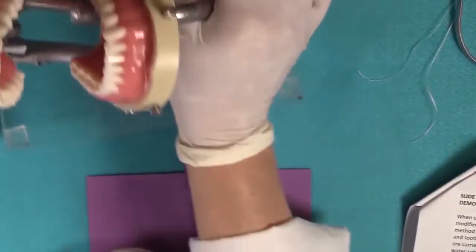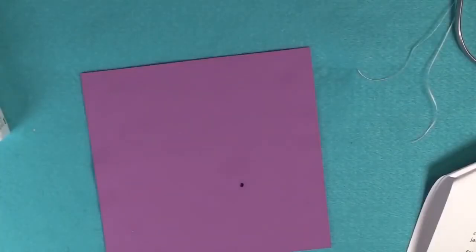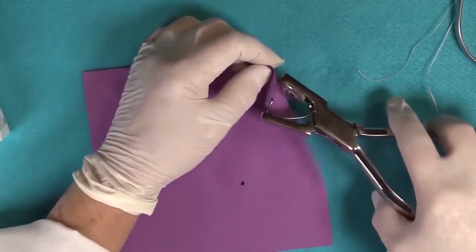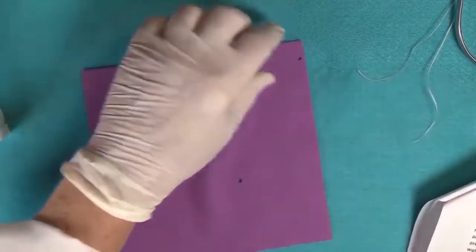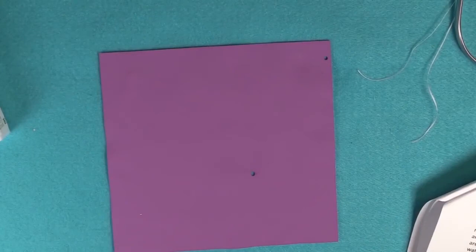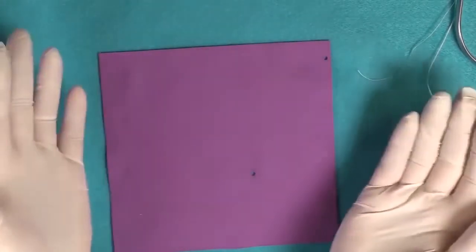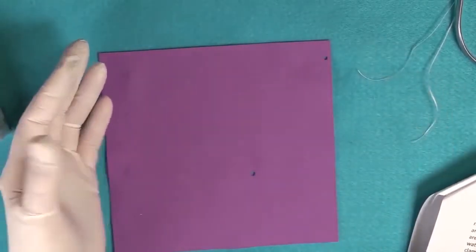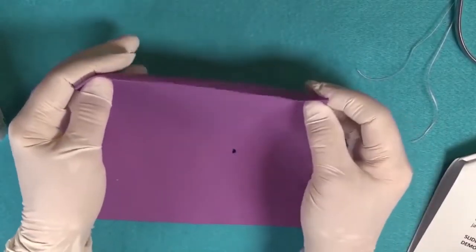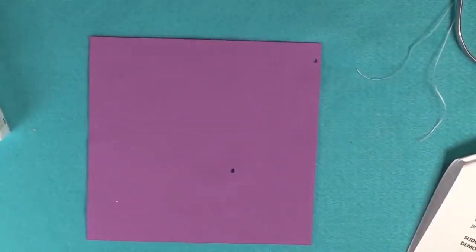Again, we could probably use the same dam that we already punched. One other trick I want to show you, particularly when you're using a wingless clamp, is to make an orientation hole. I always use the upper left corner of the patient's mouth, because with a wingless clamp, the dam has a tendency to twist in the mouth. So if you're doing radiographs for endodontic therapy and you have to take the frame off, when you put the frame back on, if your dam is twisted, then it doesn't lay right. So that helps you know where that hole is supposed to be all the time. That makes a lot of sense.